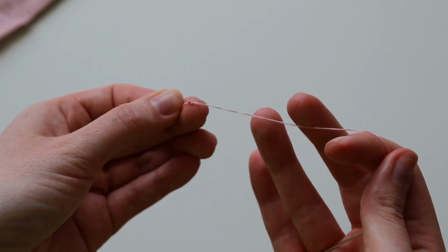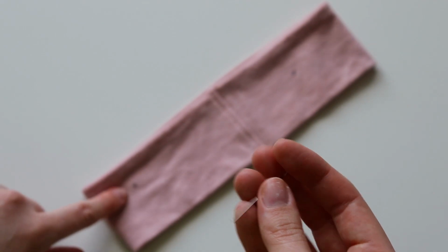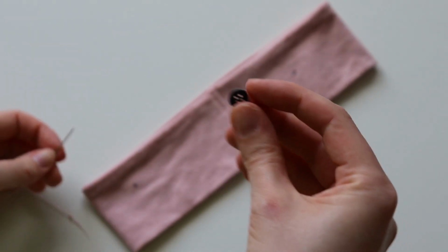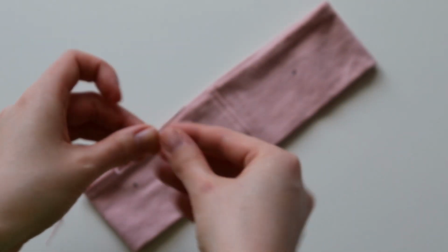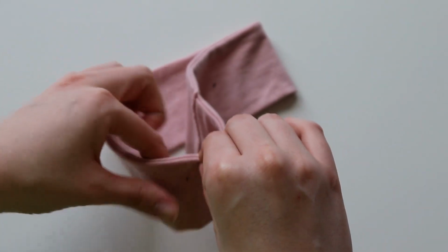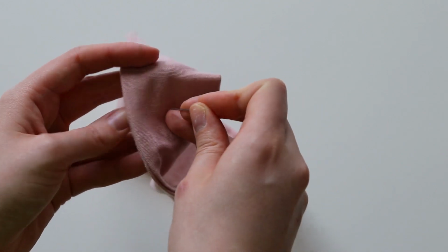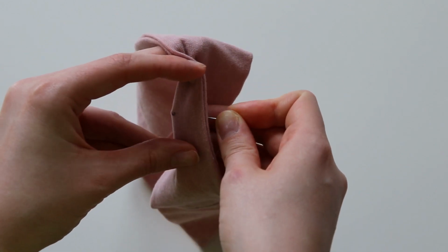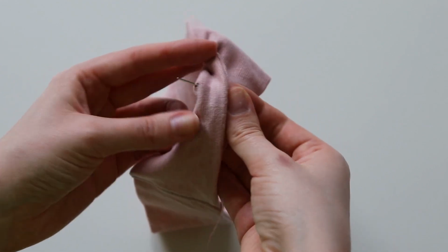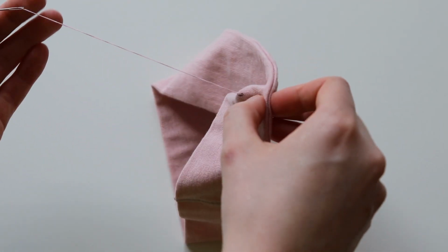And if you mess up a little bit like I did and actually have one big knot and one little one, that's okay too. Next, you're going to want to grab your headband and your needle and thread, and having one of the buttons close by, what you're going to do is make sure that you do separate the headband, don't go through both layers, but starting on the back end, what I'm going to do is just kind of peek through so that I can pierce the needle through where you've made your mark. So you're just gonna go ahead and pull that through.